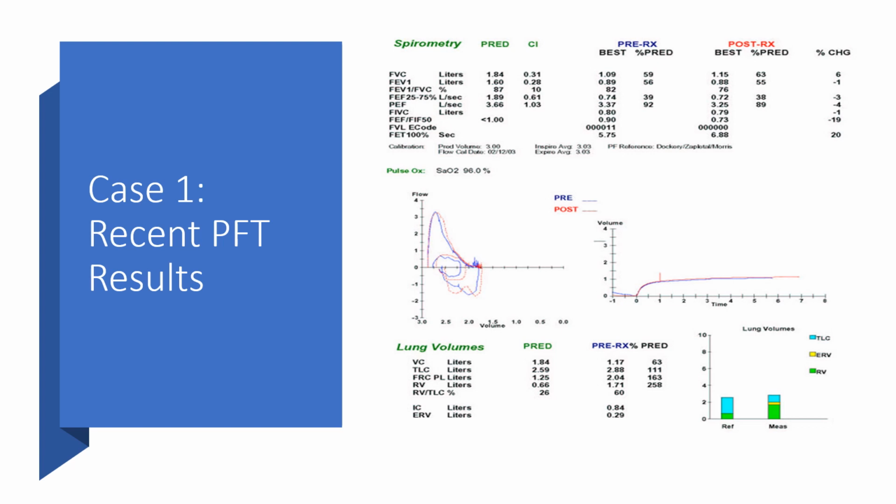The other thing I really want to point you to, and I'll do this with the other case study, is the graphic in the lower left-hand portion. So you get your flow volume loop. In this particular case, you could see there's regular breathing, demarcated by the center portion of the flow volume curve. And then you have the patient take a deep breath in. Again, below the line is inhalation, above the line is exhalation. And then out.